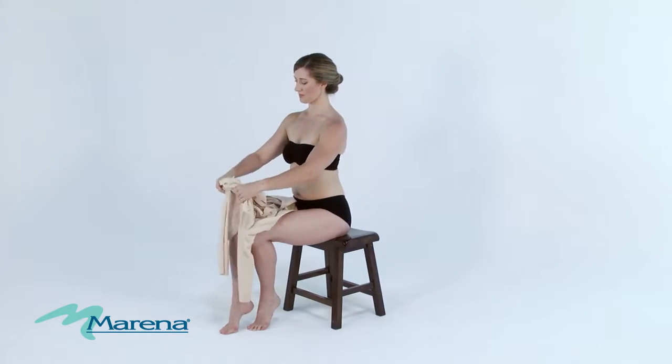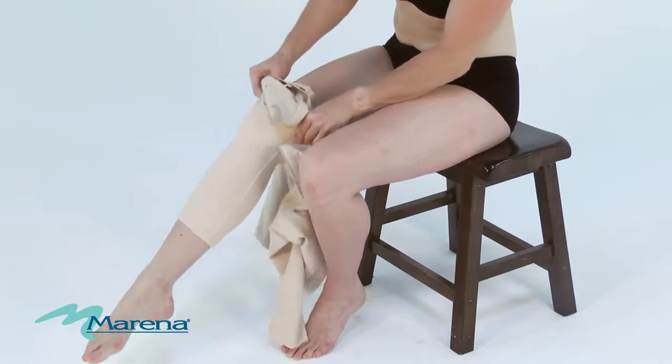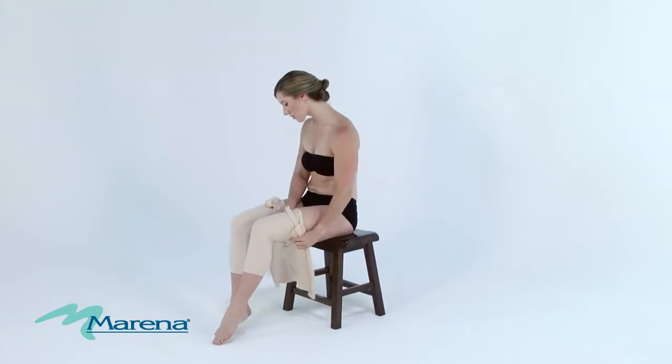While sitting, place both legs through the openings and gently work the garment up your body, making sure the groin area is aligned.